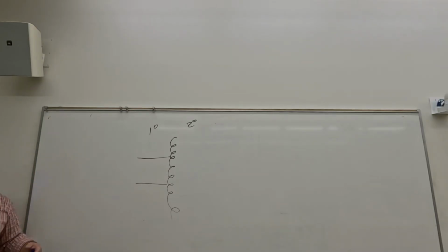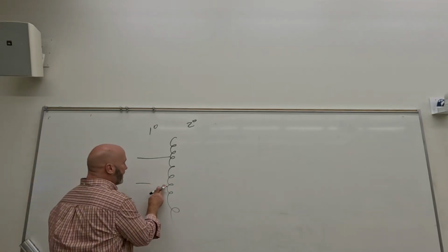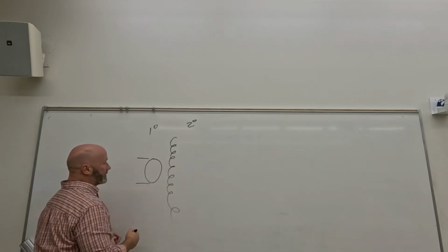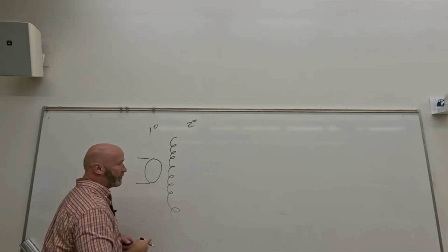But that's really not the first thing it gets to. I just hadn't had a need to tell you about this other thing yet, but now we've got to talk about it. Again, this is jumping forward just a little bit, but if you flip over to page 96, the top diagram, figure 6.6, the first thing it actually touches is what we refer to as a line monitor. The line monitor is placed before the auto transformer, and it's just a meter that tells us what our actual voltage is going into the auto transformer.